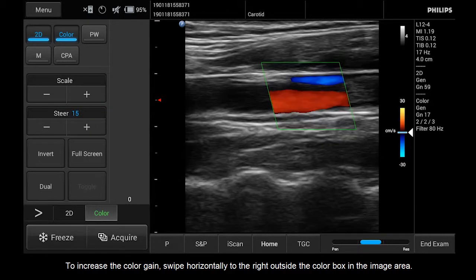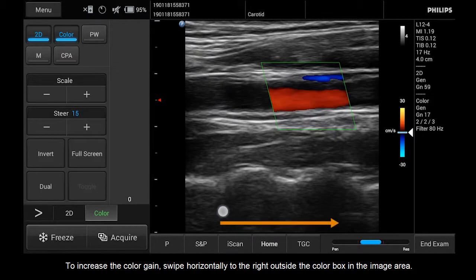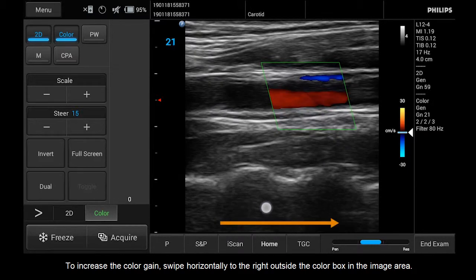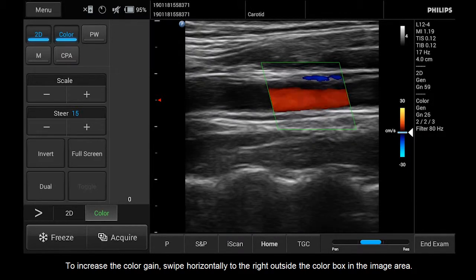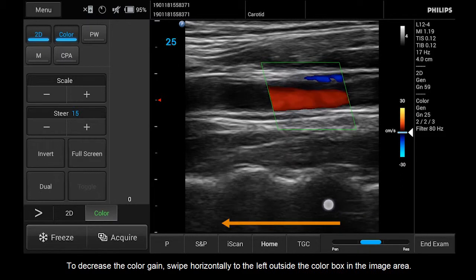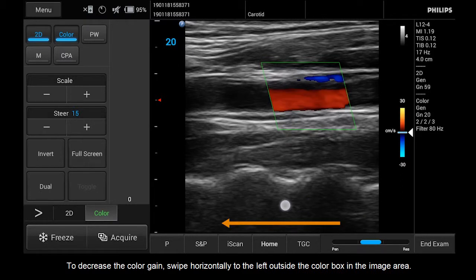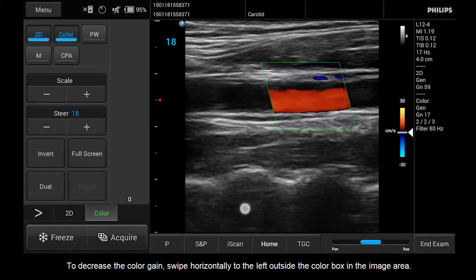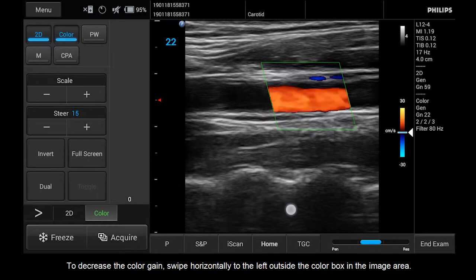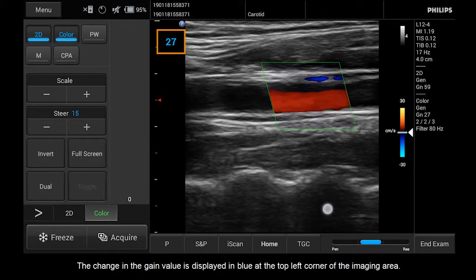To increase the color gain, swipe horizontally to the right outside the color box in the image area. To decrease the color gain, swipe horizontally to the left outside the color box in the image area. The change in the gain value is displayed in blue at the top left corner of the imaging area.